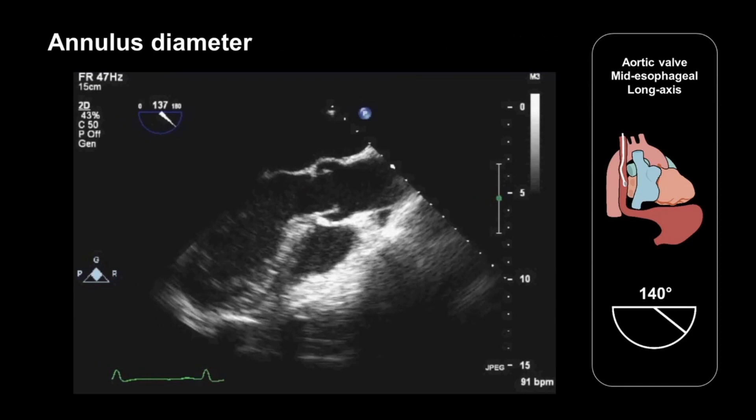We should also measure the diameter of the aortic annulus between the hinge points of the aortic valve. This measurement, together with the previous LVOT diameter measurement, should be taken in early to mid-systole. Other measurements of the aortic root are discussed further in the chapter on the aorta.